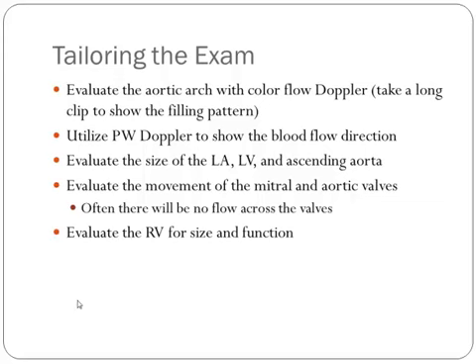Those valves by 2D that we were just looking at were moving, but you may be surprised if you actually put color across those valves, there may not be any flow at all across them. And you also want to look at the right ventricle for size and function. The right ventricle is going to be this patient's only ventricle, and if it starts out with poor function, you know, you've got an uphill battle.